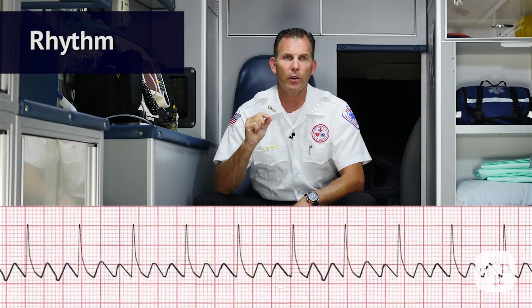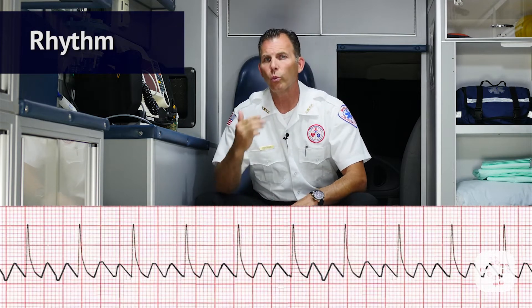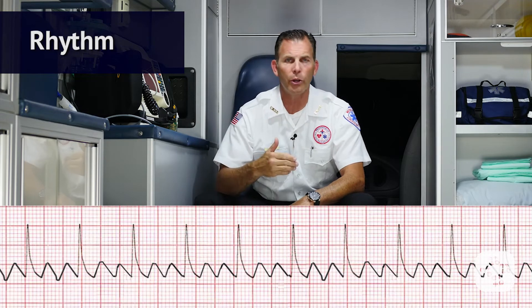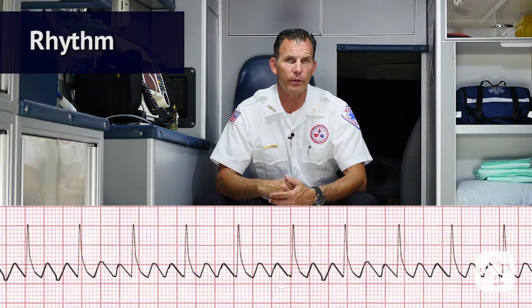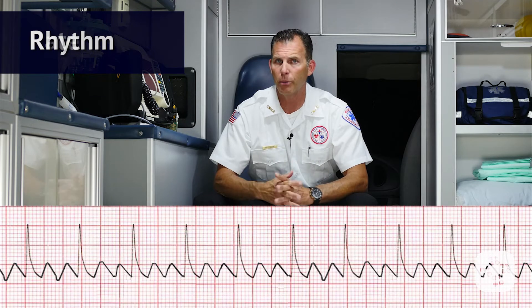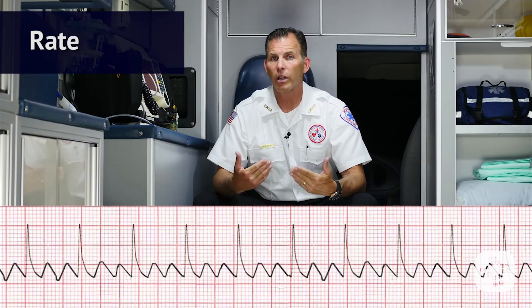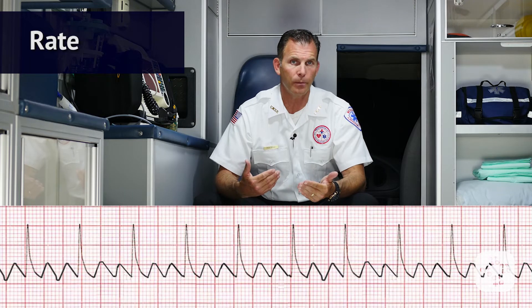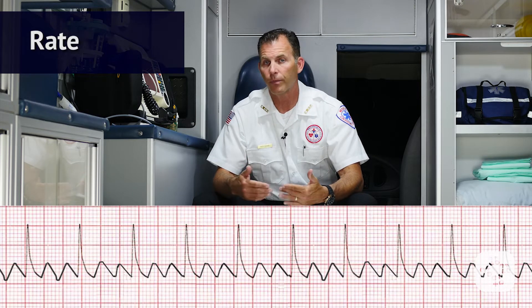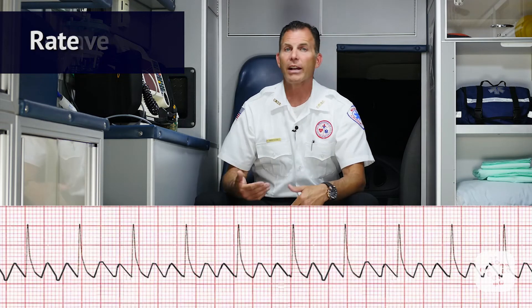Now let's take a closer look at the ECG. First, we ask ourselves about the rhythm. Is the rhythm regular or irregular? In this case, it's variable, depending on the ratio of F waves to the QRS complex. Then we ask ourselves, what is the rate? The rate is variable — is it normal, fast, or slow? In this case, the rate is variable because of its irregularity.